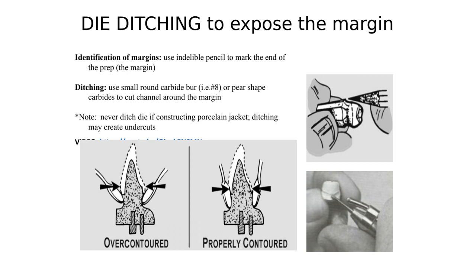Please do not use a graphite pencil, like a regular lead pencil that you write with in your notebooks. Those are contaminating. When you do the work for the wax-up and casting or pressing or whatever, that's going to create voids and problems in your casting.